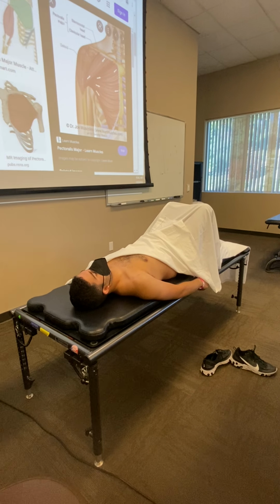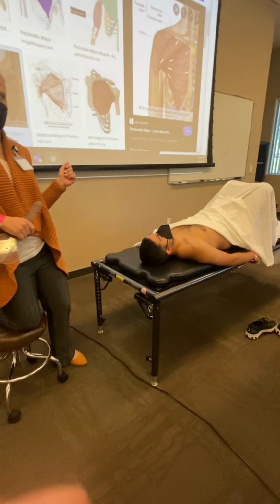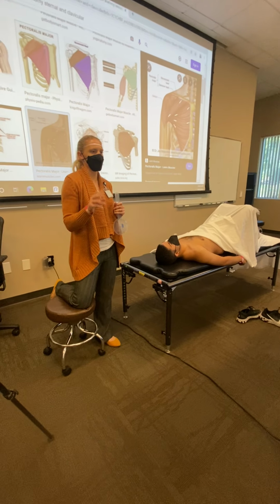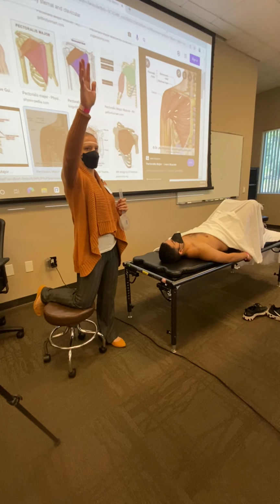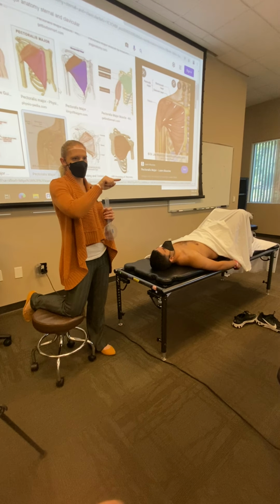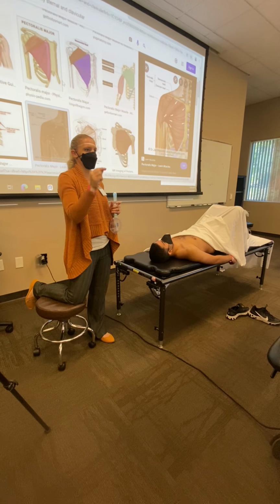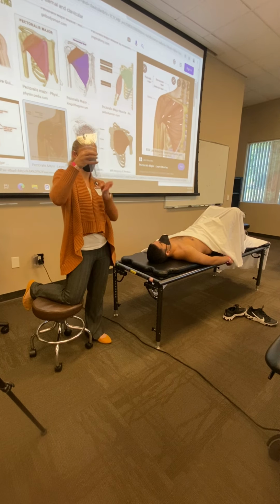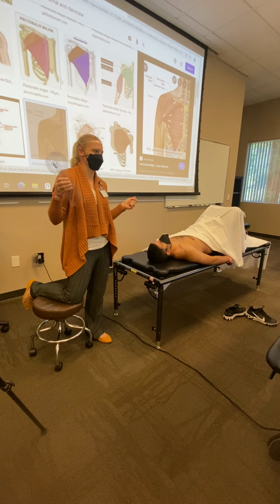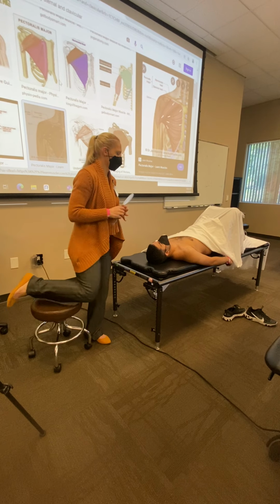So, like your lat MLT with your pec MLT, I'll show you both ways of how you can measure it. Again, you can measure the angle of the arm to the table, or you can just take a measurement of like your arm is 7 centimeters from the table, or whatever the centimeters end up being. Does that make sense? I'll show you both.